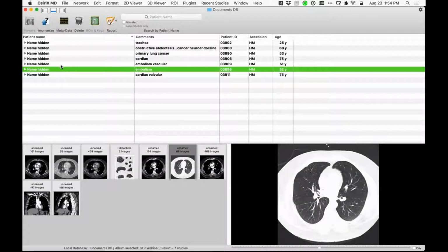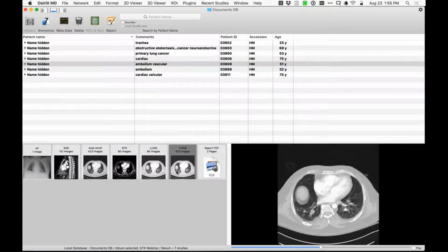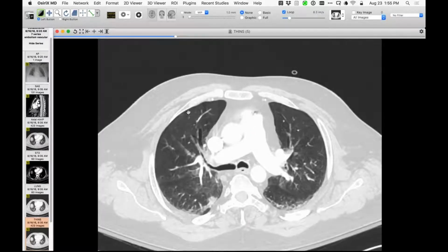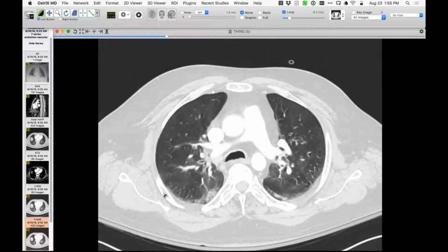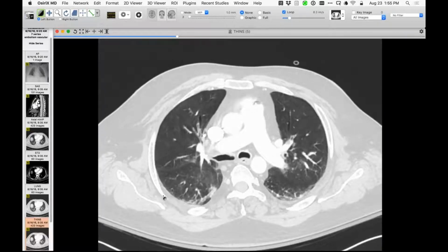All right. This is just a nice example. I shared this the other day with some folks, a trauma patient in whom a trauma CT was done. An incidental finding is the presence of air in pulmonary artery segments. So obviously, inadvertently, air was injected along with the contrast medium. As I scroll through it, you'll see areas like this that at first glance look like a bronchus, but that's actually a vessel that contains air.